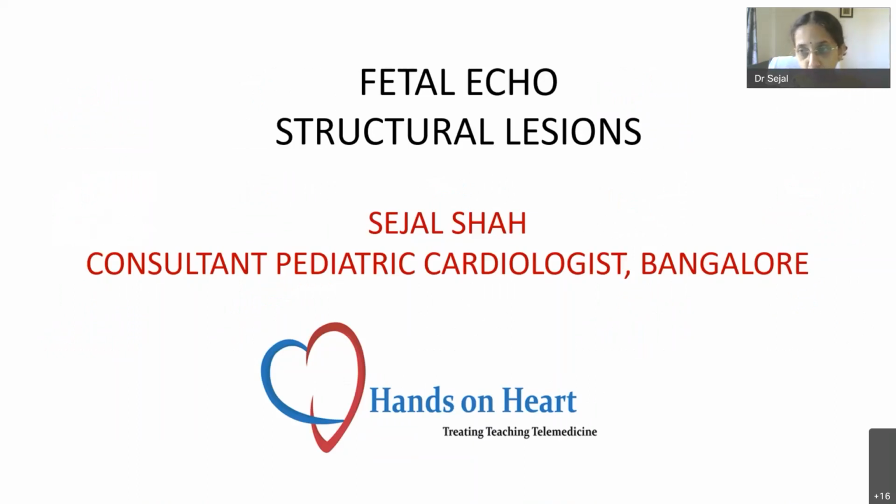What is important for all of you is to understand when to diagnose, how to diagnose. And second thing is, once you know this lesion is suspected, what do we do next? So these are the few things which I would be highlighting. Let's see how many lesions we can take in the next maybe 40-45 minutes.